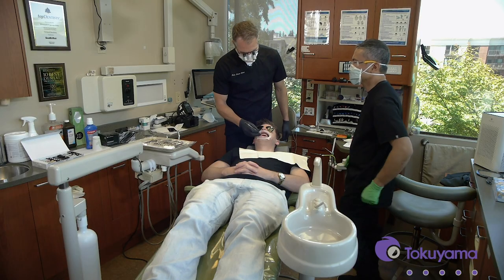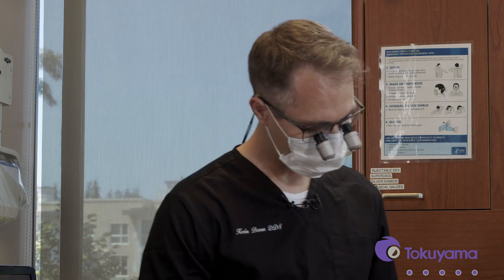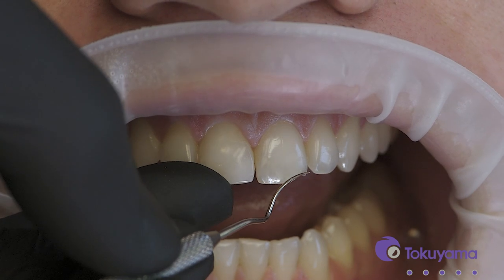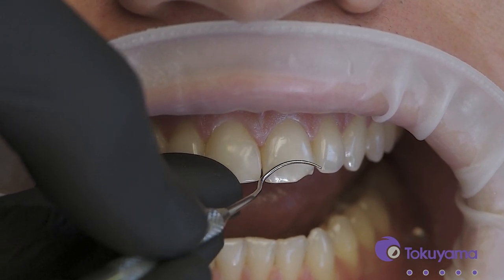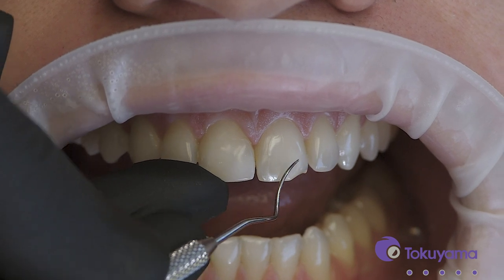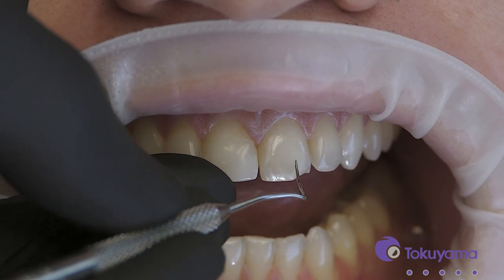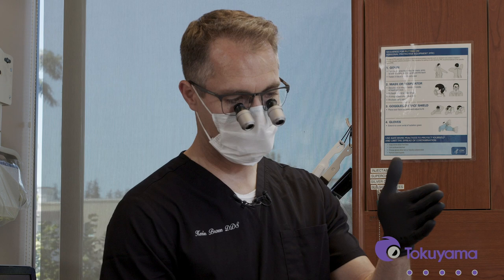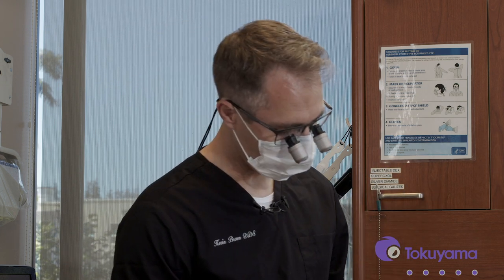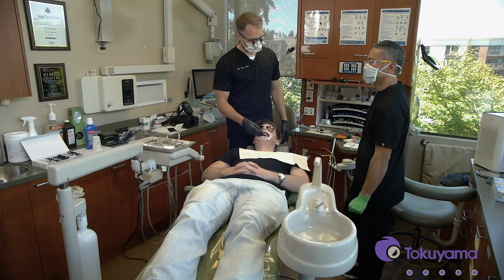First, we need to prepare the tooth. In a case like this, where we need to make sure the composite is going to be strong enough to withstand the forces Mason's going to put on there, we want to feather the composite up onto the facial surface a little ways. That'll help resist some of those protrusive forces that naturally happen. So we're going to bevel this facial surface margin — probably a good two to three millimeters up onto the facial — a real soft infinity bevel, very conservative, but just enough to allow us to feather the composite for color blending and for strength.